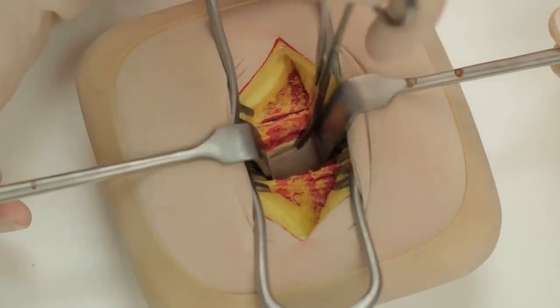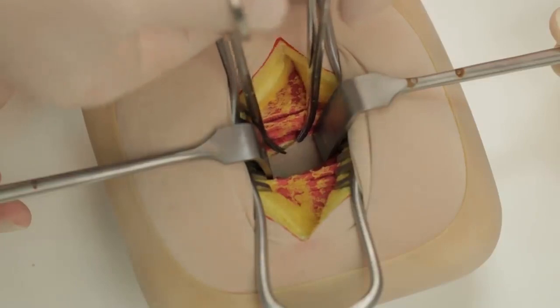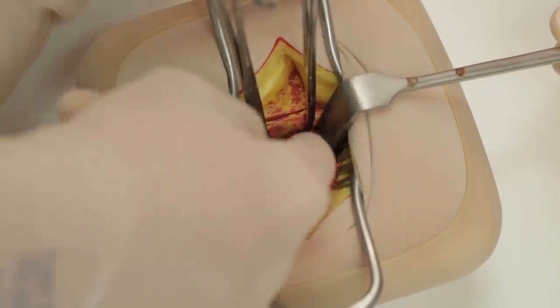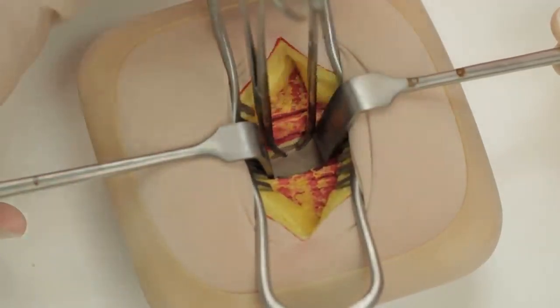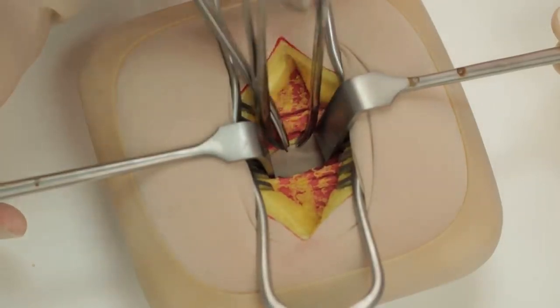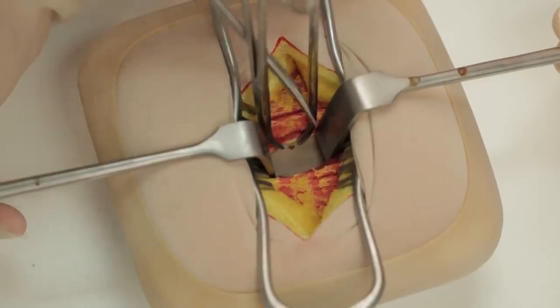Apply 2 mosquito forceps to a fold of peritoneum and ensure that only peritoneum is held by pinching the peritoneum between your fingers. Make a small incision in the peritoneum using either dissecting scissors or a knife and enlarge the hole in the line of the skin incision.